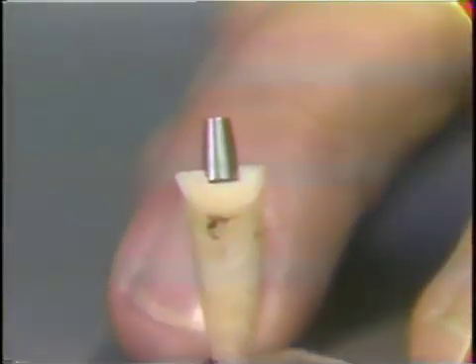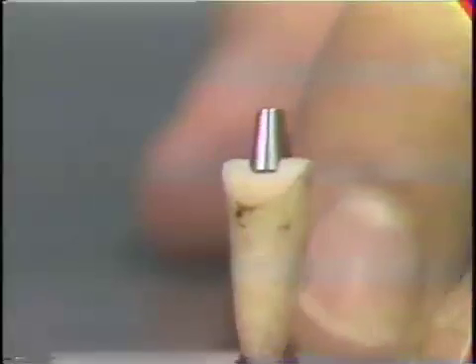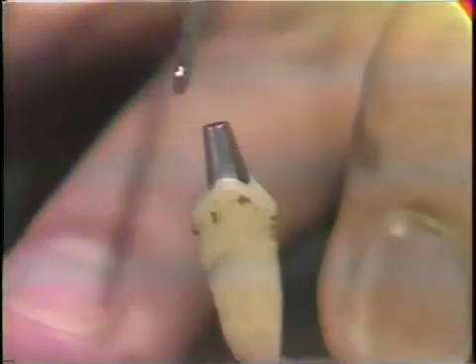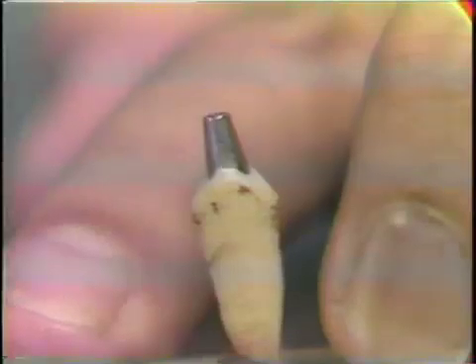And you'll recognize now that this is the prefabricated shape to the core. It's not been finished or shaped to match the preparation. It will be too wide across the incisal in its present form, and of course in shaping the labial and lingual surfaces you develop the same shape which you've seen in the earlier preparations. The finished core post is then cemented in position and an impression taken, and the usual procedure followed for the construction of a veneer crown.